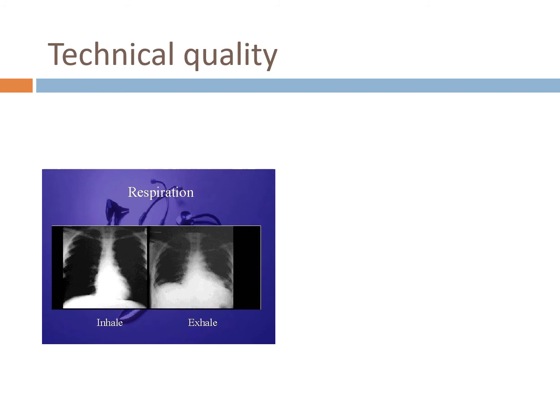Sometimes, obviously, they are familiar with the ventilators and they try to time it with the breath. Sometimes if you're in the ER and you just intubated a patient, they want to do a chest X-ray. You're often left in there with the rad tech because you might not have the vent hooked up quite yet. Back in the old days, it seemed like we bagged our patients for a CT and stuff.